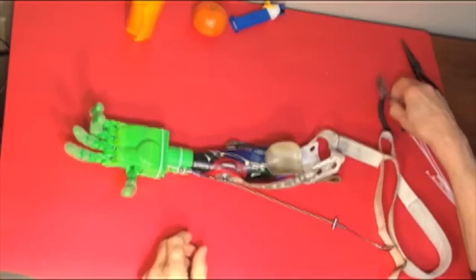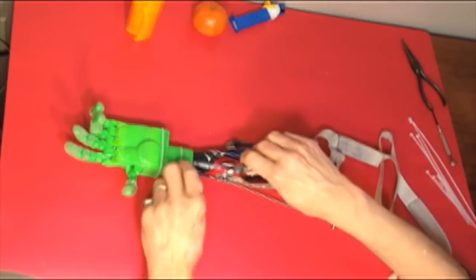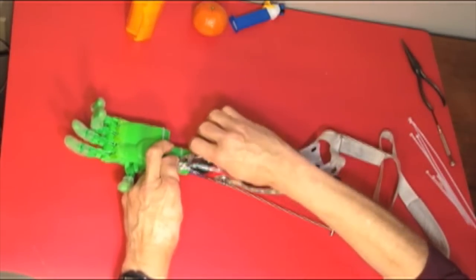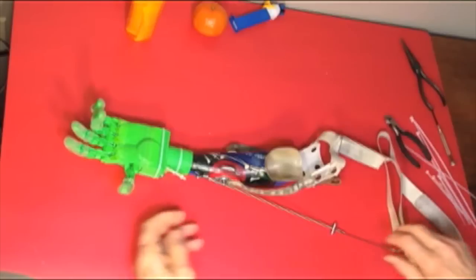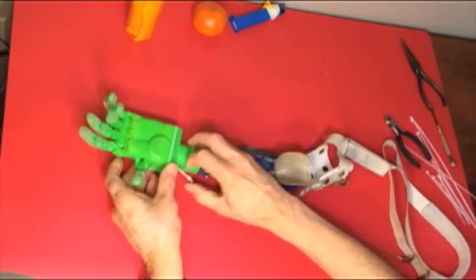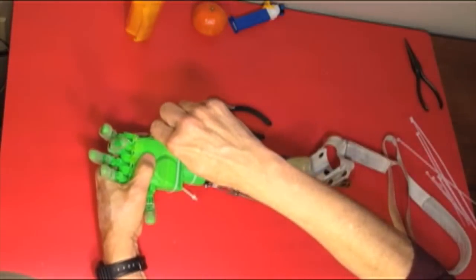Wilhay wears the prosthesis with a harness and he can cause the fingers to grasp by shrugging his shoulders or extending his arm to pull the cable attached to the tendons of the fingers.